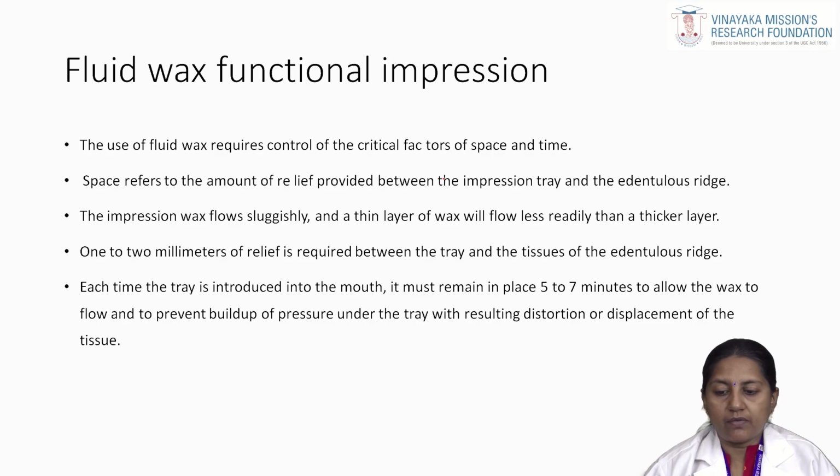So this time you have to note. Every time you are going to place the fluid wax into the patient's mouth, it must remain in place for 5 to 7 minutes to allow the wax to flow and to prevent the buildup of pressure under the tray with resulting distortion or displacement of the tissue.